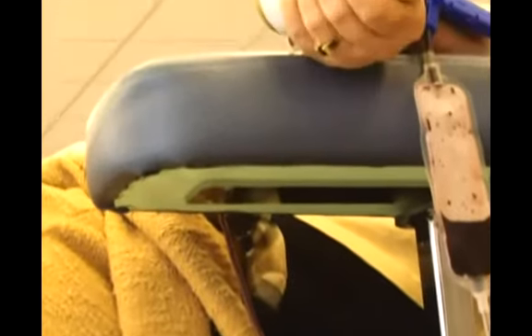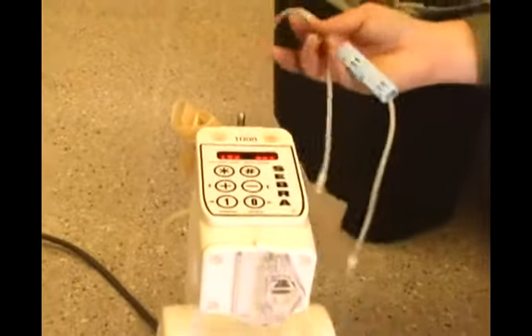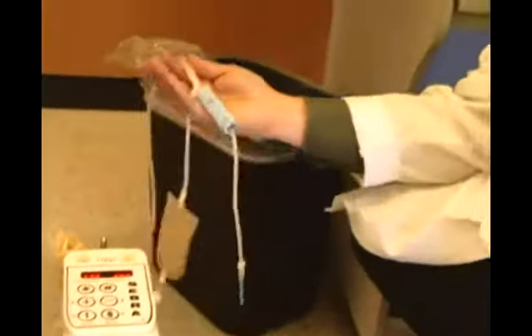And then on the top, it has a digital readout of how much it weighs at any time. The collection goal for this is 565 grams. Now that's including the bag weight, so it's about 475 grams of blood or one pint of blood.